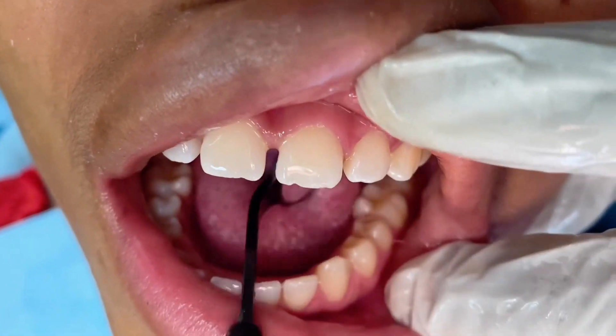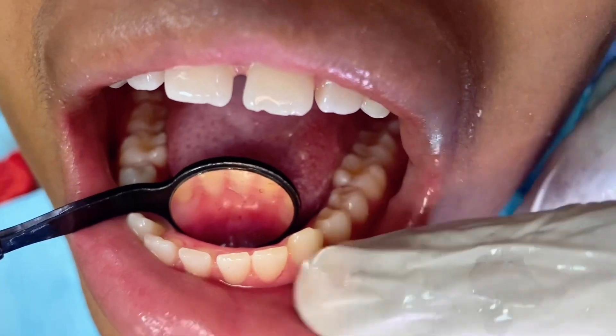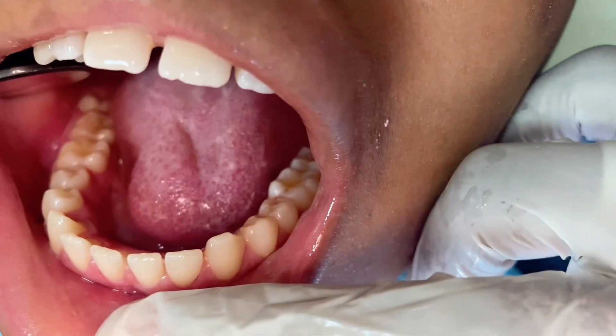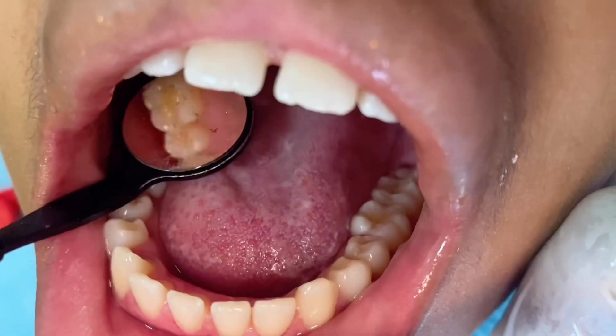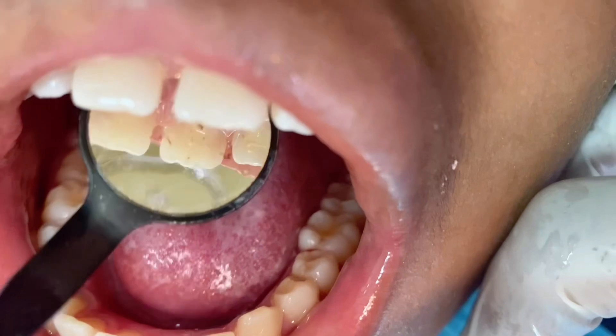Afterward, you have to look at the mouth closely and check whether there is any tooth decay — meaning a hole or cavity — and inflammation of the gums as a result of gum infections resulting in pockets. You have to take a closer look at the gums, and if there is any, it can be treated.